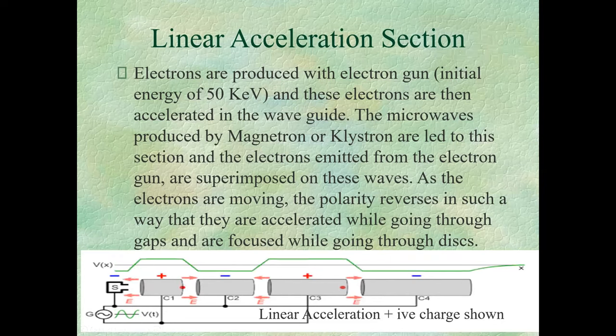As an FYI, when you are looking at an electron curve, the X-ray contamination starts 2 centimeters after the R_p, which is the practical range of electrons. So when you scan your energy next time, look at the curve closely, and it is close to zero. At one point, we have the practical range of electrons, and 2 centimeters after the practical range, the amount that we get is the X-ray contamination of your electron beam. For any energy, you can look at that and calculate how much contamination you have.